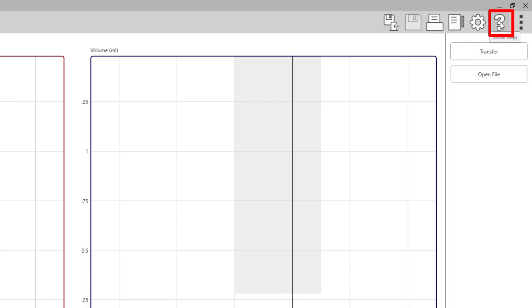The question mark icon will allow you to access the help files for each individual test module. You can also search specific tests or topics in the search tab of the help files.